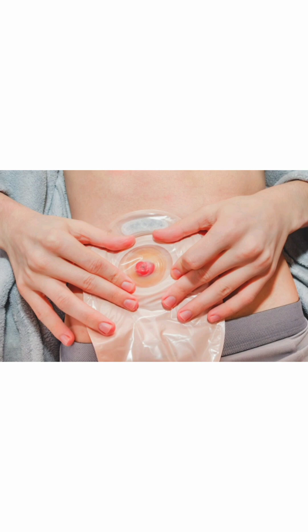Then it is very essential that whoever is doing the stoma care must observe for any changes of color, shape or size, because complications may further lead to suffering by the patient. So change the pouch regularly, like every 4 to 5 days, and on the day of changing the entire stoma bag, the person needs to take a shower, or they can bathe with soap and water.